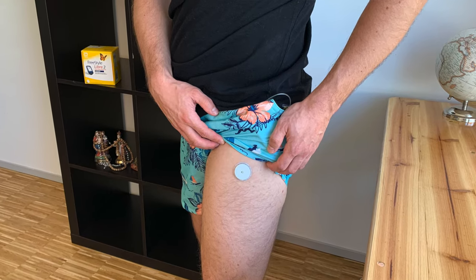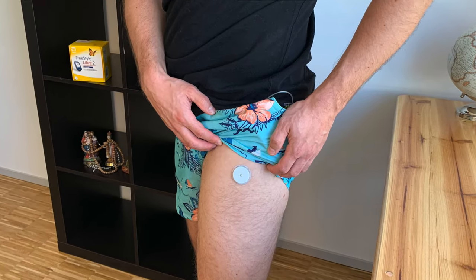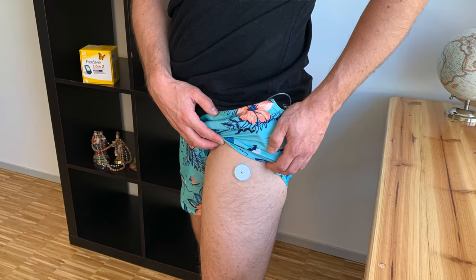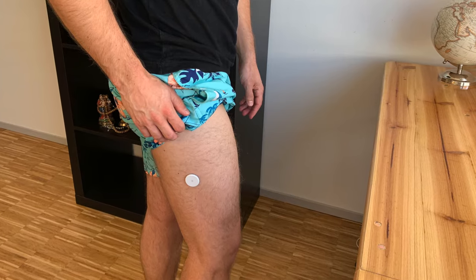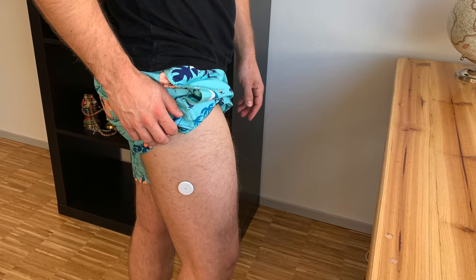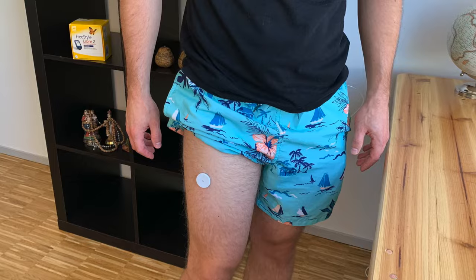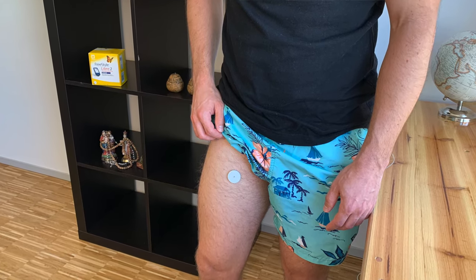The first category is placement. Right now I have the sensor in my outer upper thigh, approximately 3-4 inches or 10 centimeters from where my leg connects to my torso — approximately in the same spot where my pants pocket is, so I can comfortably scan with the phone in my pocket. I've also seen other diabetics putting the sensor a bit lower on both the outer and front side of their leg, or on the inner side where it's more hidden if you want to avoid questions from strangers.